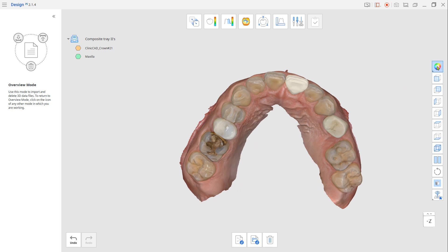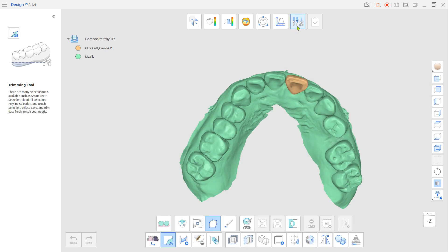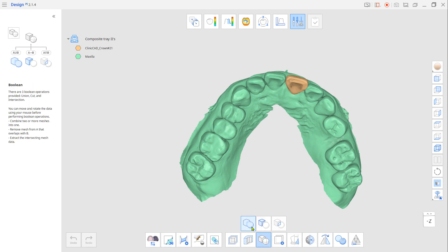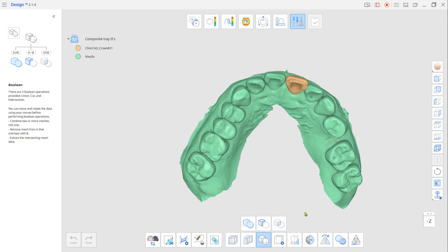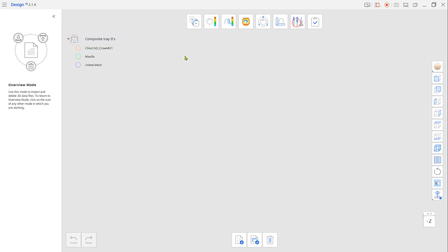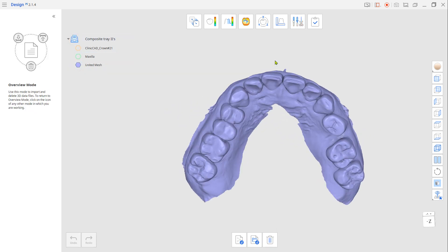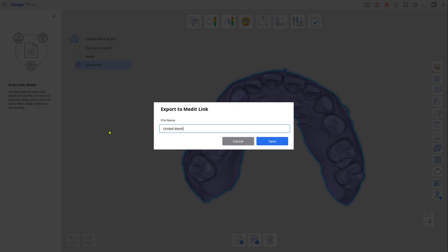Go to Edit Mode and use Boolean Union to merge them together. Export the united mesh to Medit Link and exit without saving.